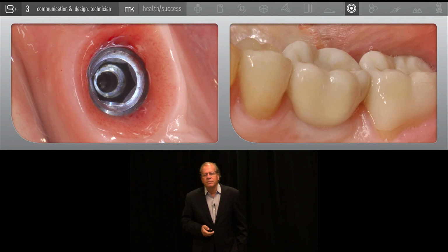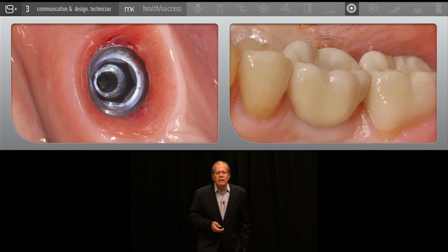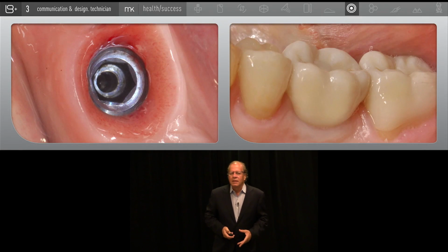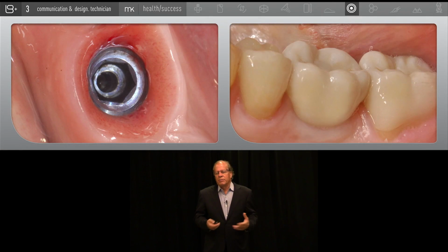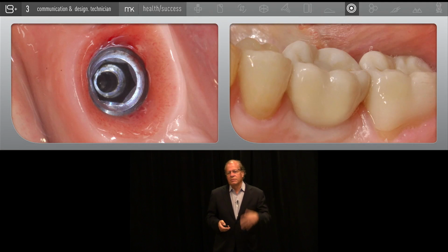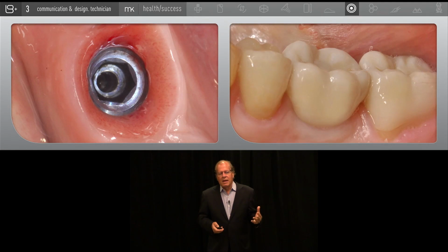So what did we do to convince ourselves? And this, by the way, all ties into this abutment design. I'm not trying to get off track. We took a number of patients who had long-standing implant crowns in position with ideal soft tissue contours and emergence profiles, and they were screw retained, so they were easily retrievable. We unscrewed them, and we put them through a digital scanning process and worked in a reverse direction.